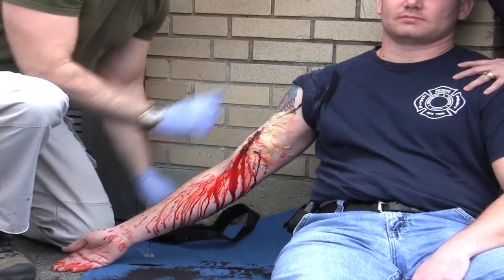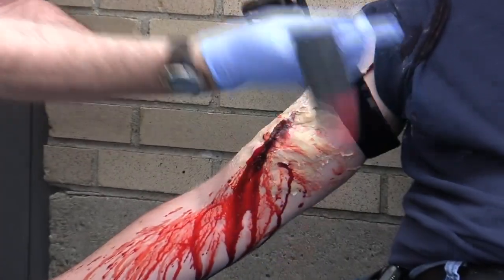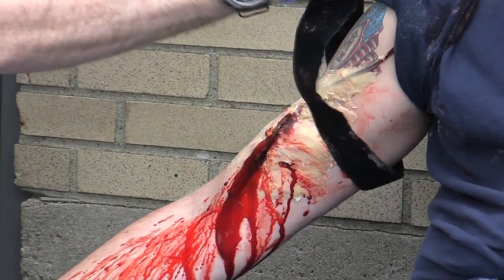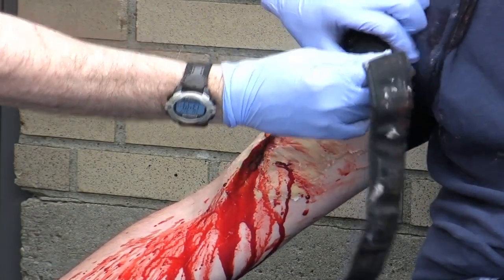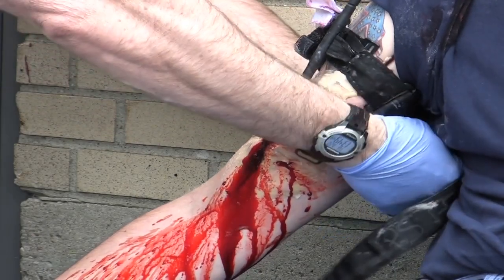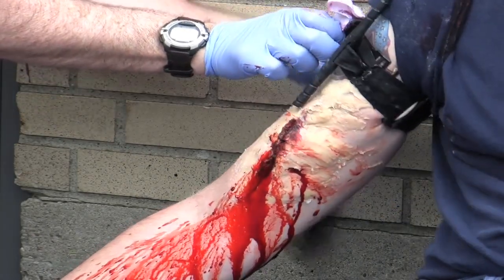Try and find the source of bleeding and place the tourniquet around the wounded extremity. Ideally, this should be placed 2 inches above the wound. Place the free end of the tourniquet through the slot on the buckle that is closest to the strap and pull the strap tight and adhere it back onto itself. Do not go past the windlass clip.